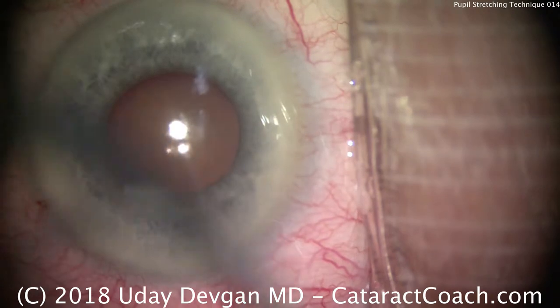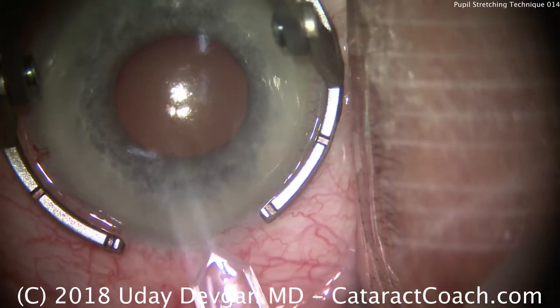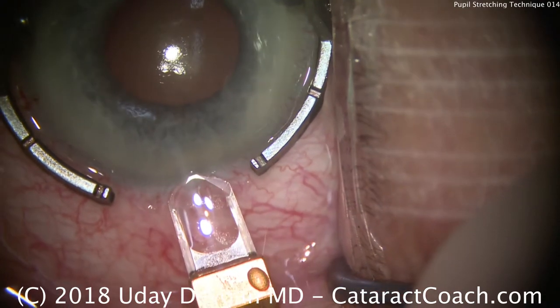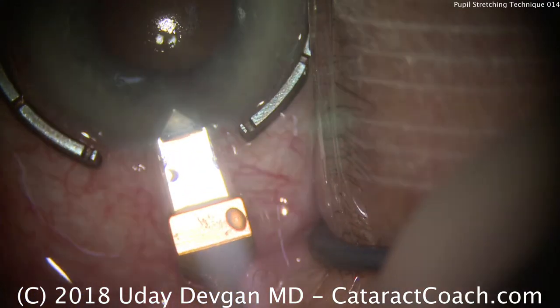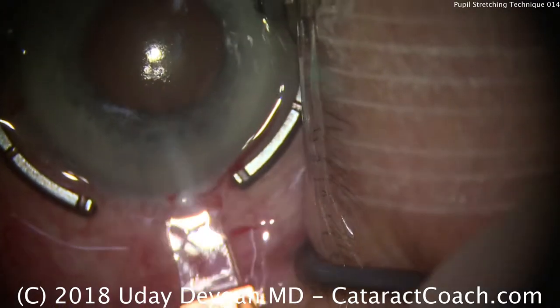Put our fixation ring down. We'll make our temporal incision. We're using a diamond keratome here — single-plane incision, barely nicking limbal vessels. Nice tunnel length, and entering the anterior chamber. That should seal beautifully.